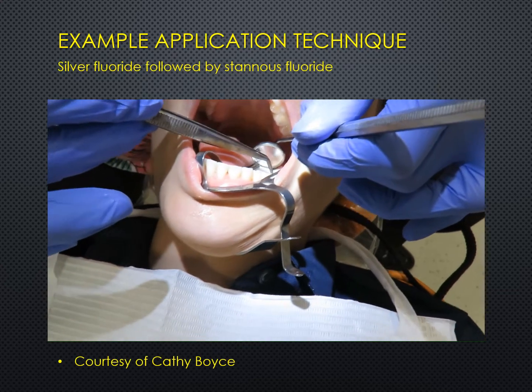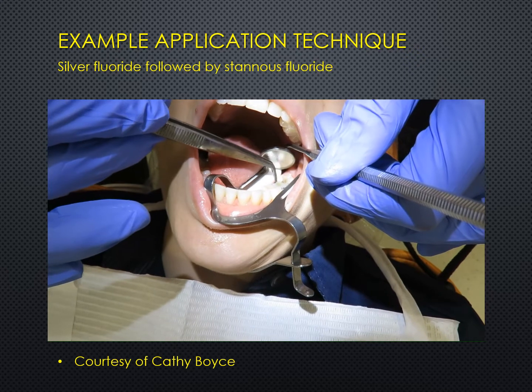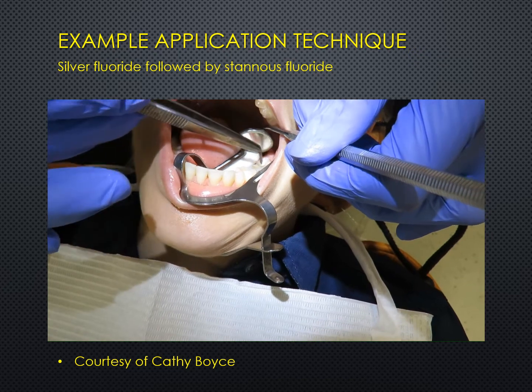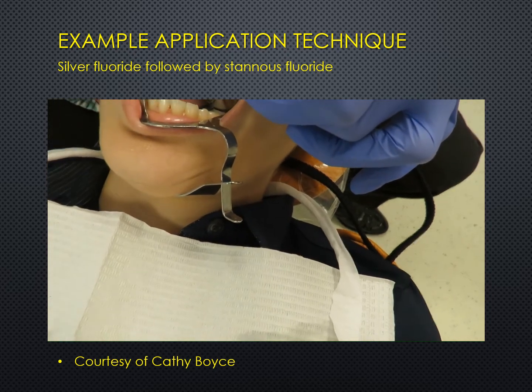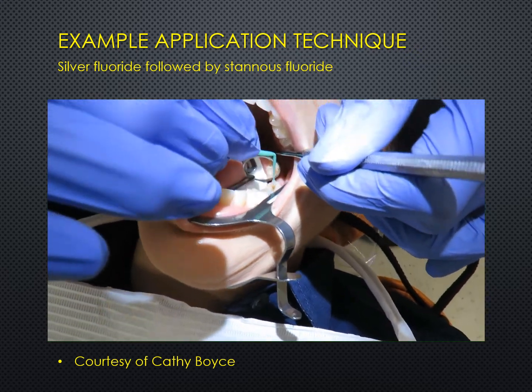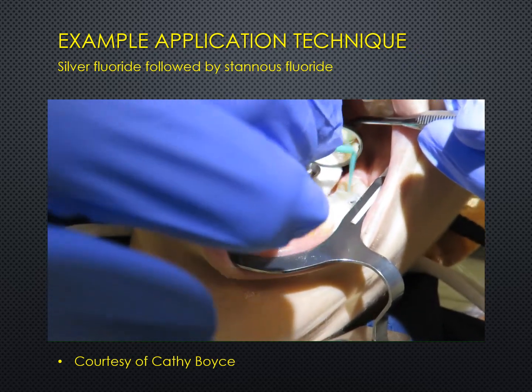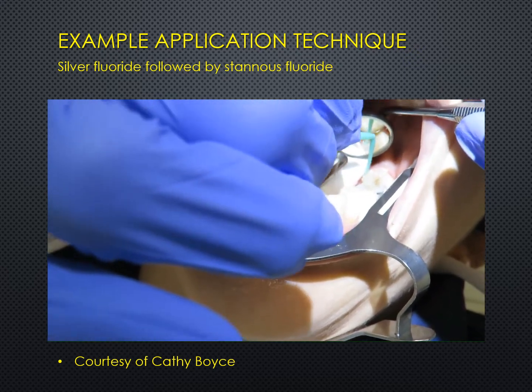I'm just drying this tooth off with a cotton pellet. Normally we would air dry this, but we are unable to create aerosols, so I'm drying it as best I can — and it is very effective even with this. Because we are using a silver fluoride that is water-based, we don't have to worry about protecting the gingiva. I can really apply it down around there because this is a 6.3 pH, and we can leave it on for three minutes without concern. The longer the application, the more uptake and the better the result.